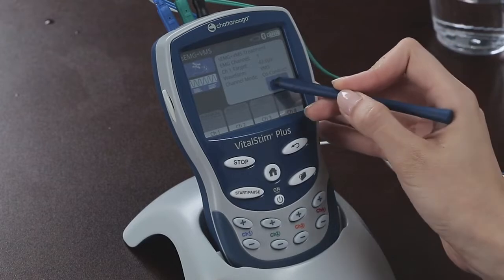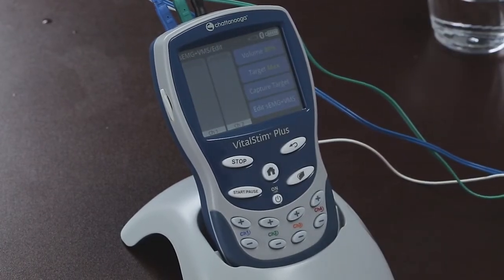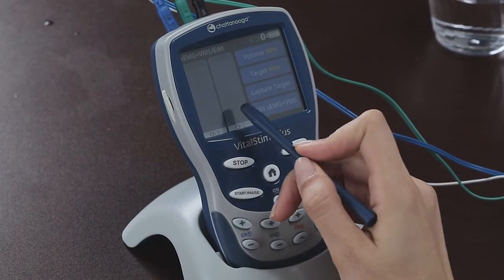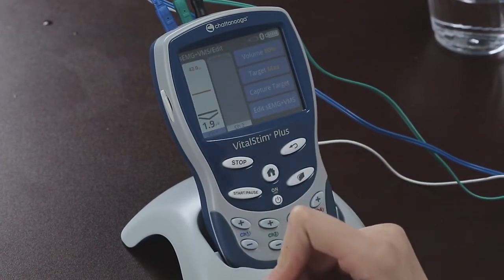So pressing EMG triggered stim will get us to the point where we can set the parameters for both the stim and EMG. So let's press the gears icon, which is the setting button, to edit these settings. First, let's make sure that channel 1 is connected to the triggering muscle group. In this instance, it will be the geniohyoid.